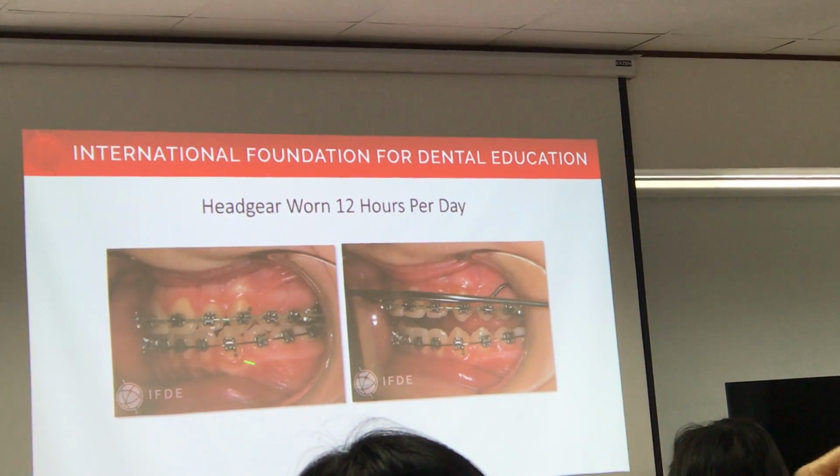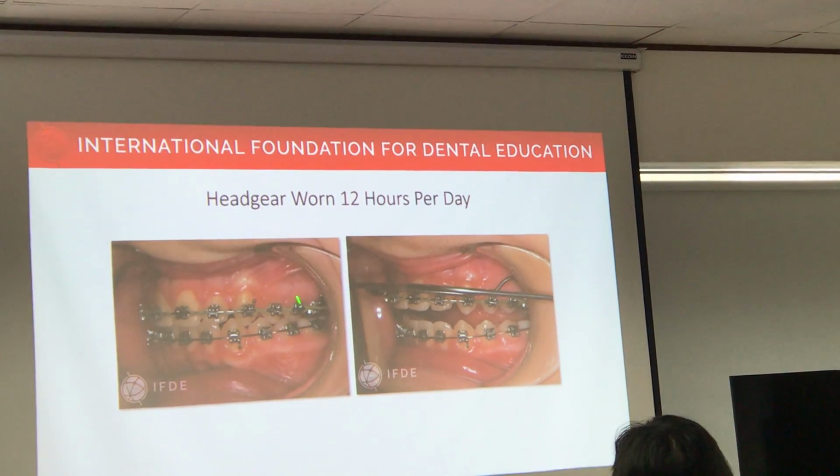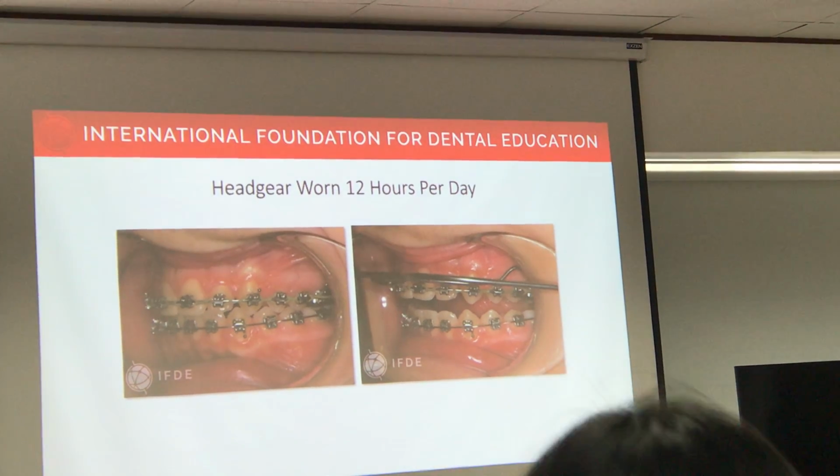So if you're able to set up the occlusion correctly, like here slowly, the front will take care of itself.